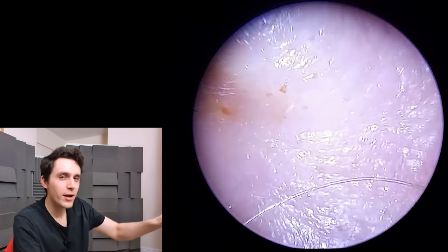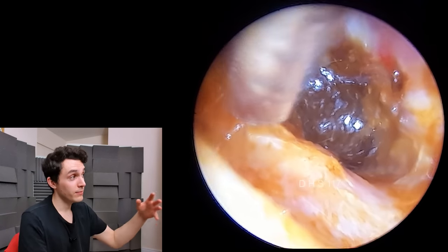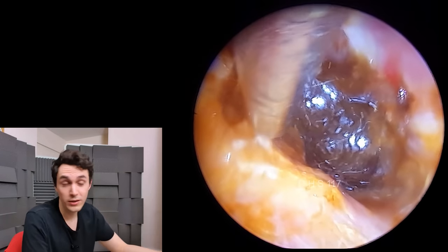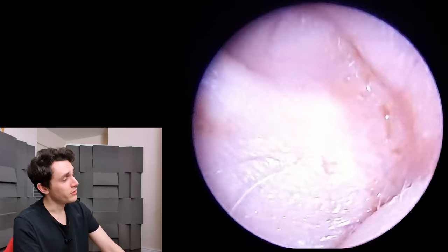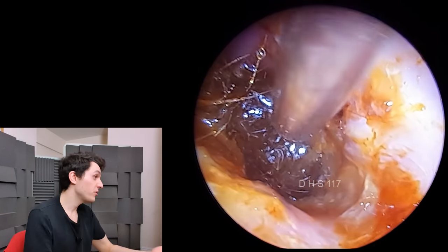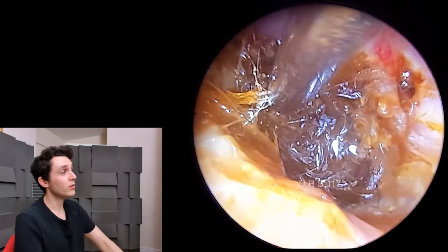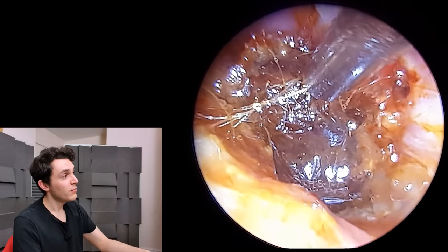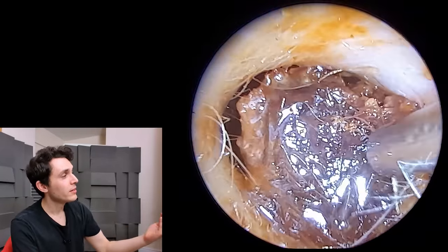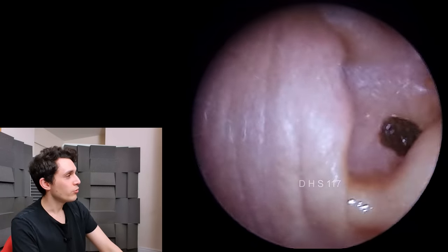You can just see the ulceration on the right hand side. There's olive oil in here. I let this olive oil sit for about 15 minutes — I applied the olive oil, put some cotton wool in and told the patient to wait in the waiting area for 15 minutes. Partly because I was running behind and this procedure had overrun, but also it was just nice to let it sit there for a while to soften things up. And now this final crust, which was overlaying the eardrum, I've brought forwards. There we go — dropped it, but recovered it.